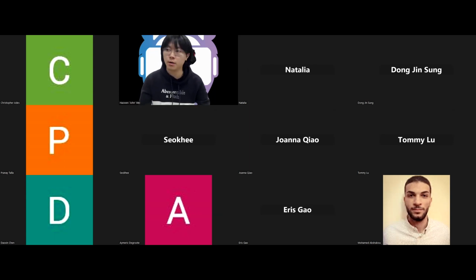Perfect. So I think we can get started. Today will be a very interesting topic. PhysioLabXR is a software platform we built for real-time brain-computer interface. Let's get started.